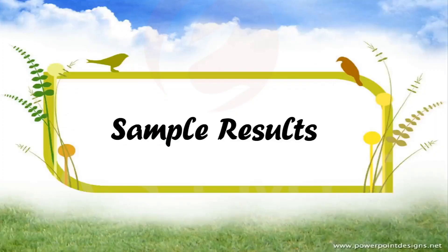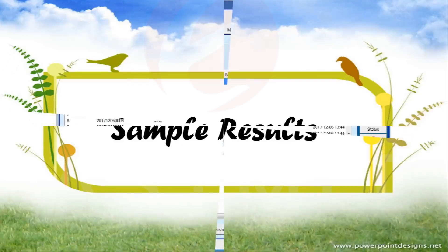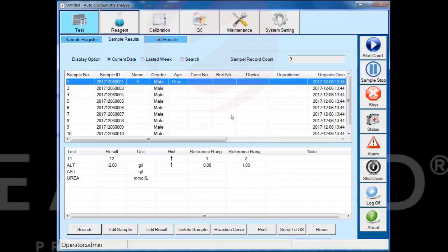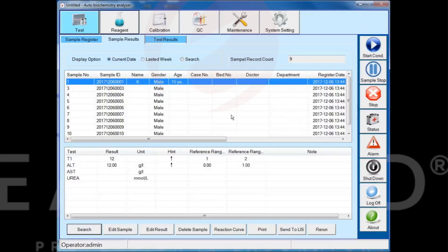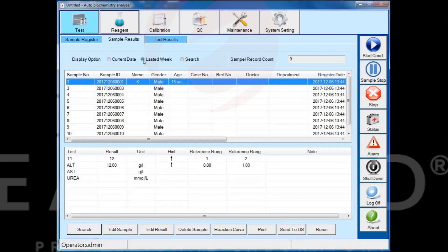Third part: sample results. In the sample results interface, you can view the registered sample information. By selecting current date, last week, or search, you can find registered sample results from different time periods.